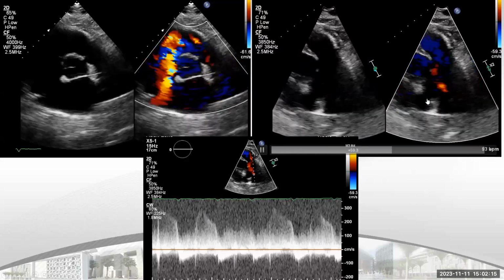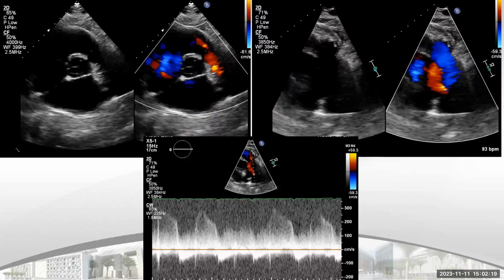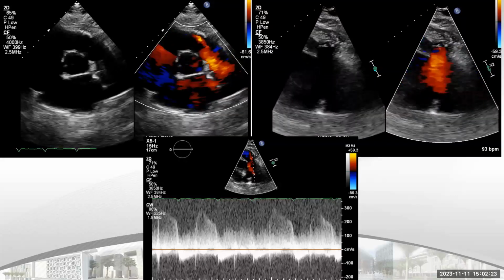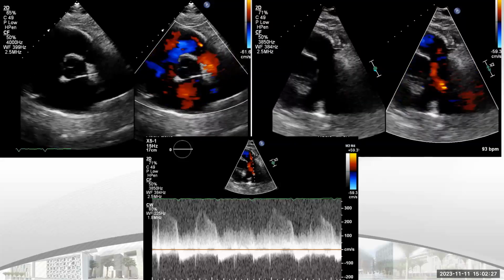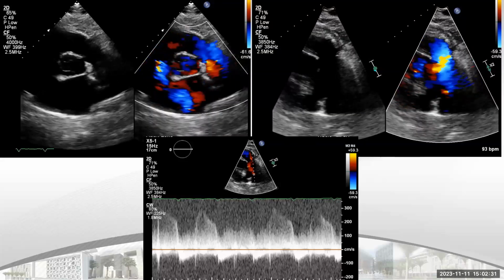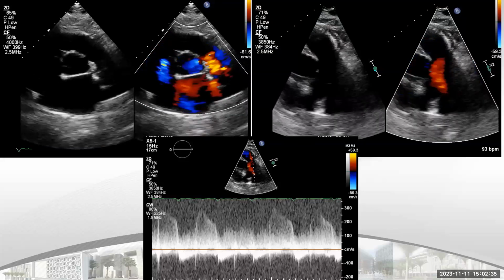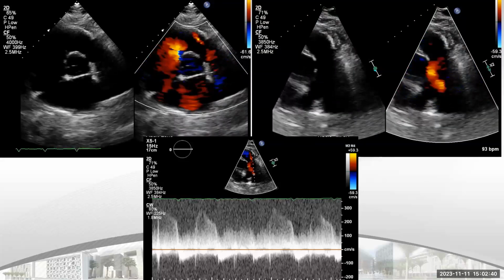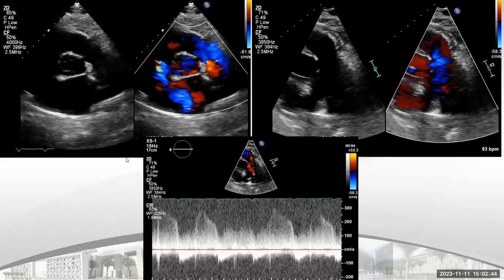However, generally, if you have any continuous flow, usually in one direction, this could be PDA or in case of shunt. In shunt, especially if you have ASD, usually the flow at early stage is unidirectional from left to right. And if it becomes significant pulmonary hypertension, you have bidirectional shunt. And in case of Eisenmenger, it is purely right to left, and this is a very late stage. Okay, good.